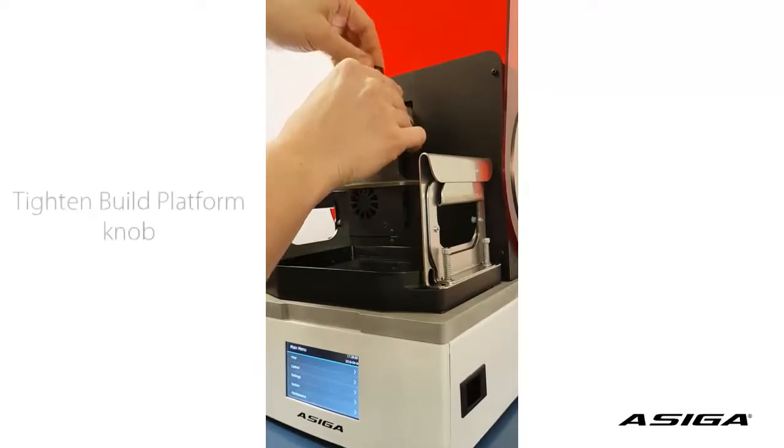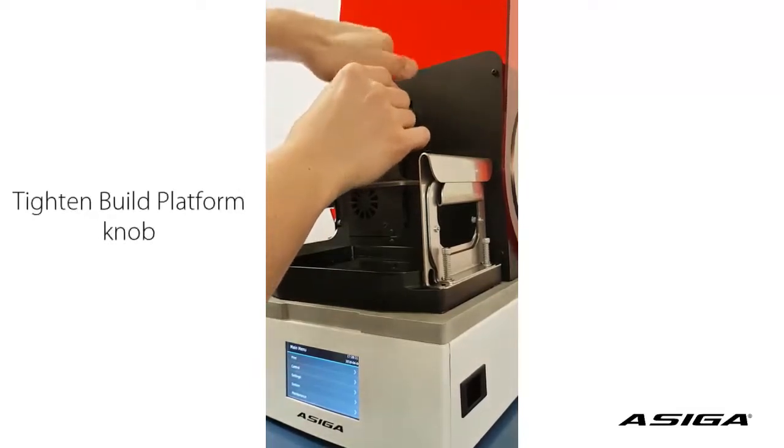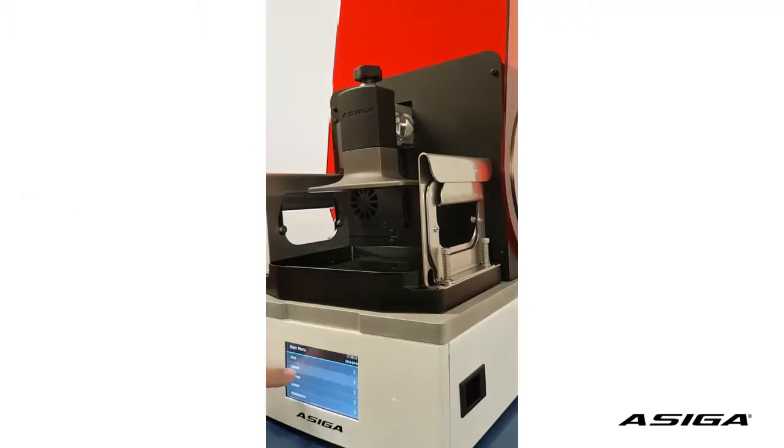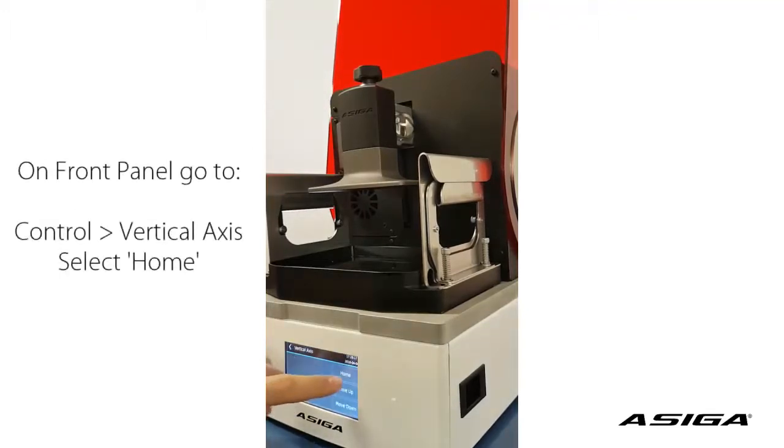First of all, tighten the knob of the build platform so it sits tightly. Make sure your platform is home — just go to vertical axis and home.